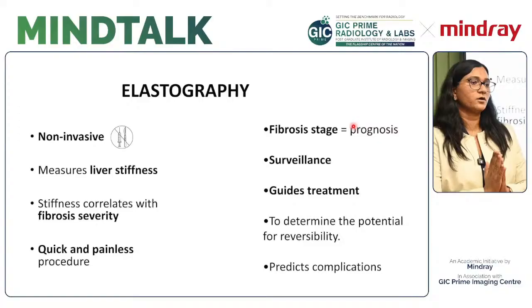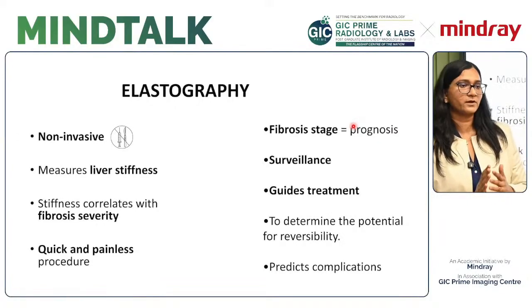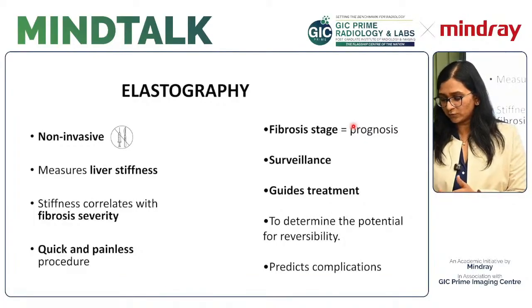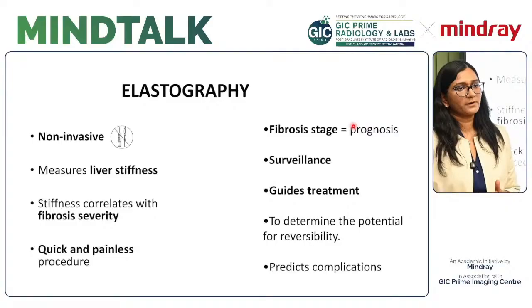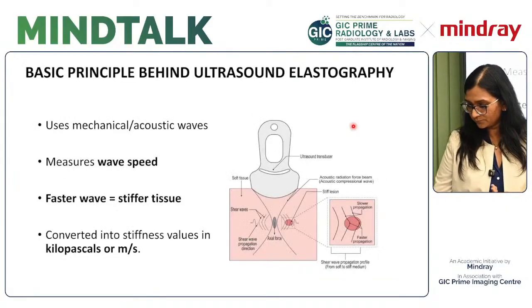Then comes the role of liver elastography. It is a non-invasive, quick and fast technique to measure liver stiffness. Liver stiffness depends on the stage of fibrosis, and this will guide us to provide further treatment and prognosis and surveillance.